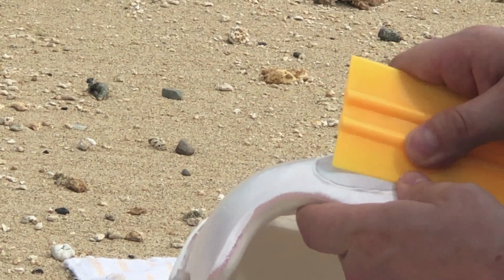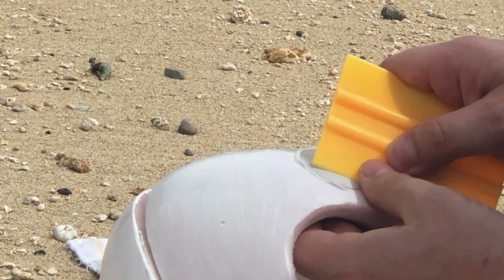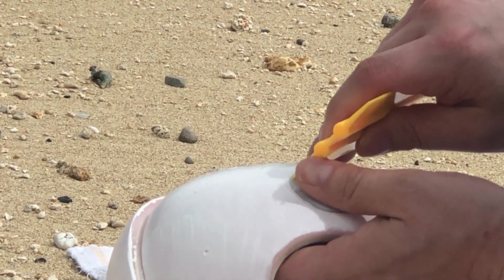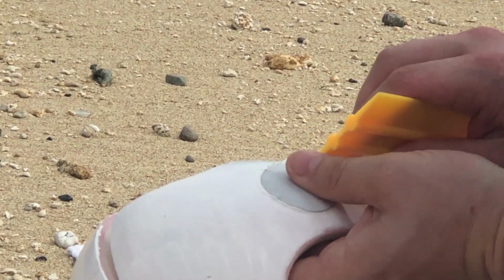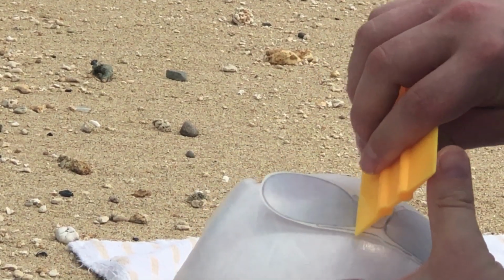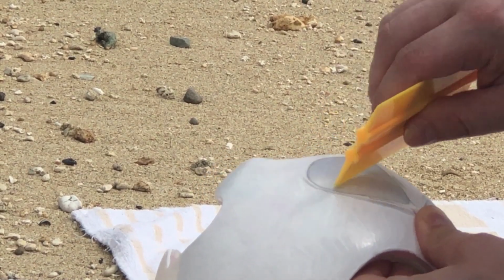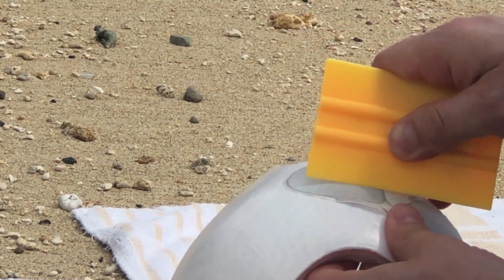Some people ask if the squeegee is really needed. Yes, you can use a credit card instead, but it is not the same. I find that credit cards are very hard and they have a sharp edge. They want to dig in instead of sliding. With small decals, you can probably just use your fingers. But with anything big enough to not want to go flat, it is going to need some pressure, and you need something like a squeegee or a credit card for that, but the squeegee wants to slide and the credit card wants to dig in. For $2, I feel like it's a good investment for any design that has larger elements.